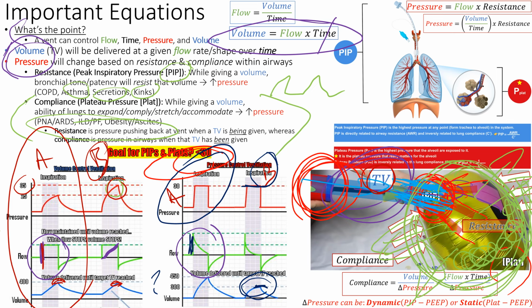Okay. So patient A though is healthy. You're going to get about 450. All right. Pressure control ventilation. You're only in charge of the pressure max in the chest. Okay. That's an overview of our volumes and pressures and modes. Now we're going to deep dive into each one.